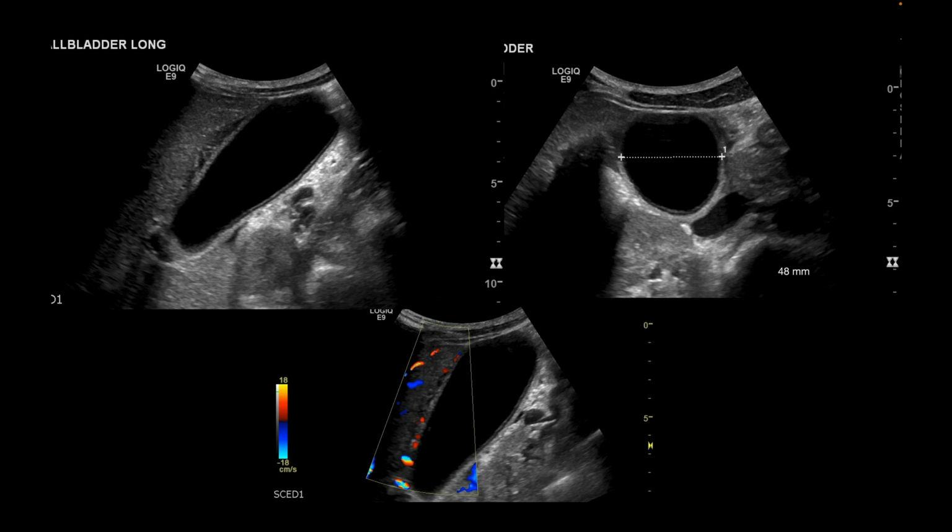We're looking for thickening of the gallbladder wall, so we're looking to measure the thickness, and if it's over 3 millimeters, that suggests some inflammation or edema of the wall. You can put the color flow Doppler on and see if it's inflamed. Is there hyperemia or increased vascularity of the wall? But probably the most important sign for point of care clinicians is that sonographic Murphy's sign. So we try and bounce the probe over the true fundus of the gallbladder, and if it's tender, the patient will let you know straight away. So documenting a sonographic Murphy's is very useful.